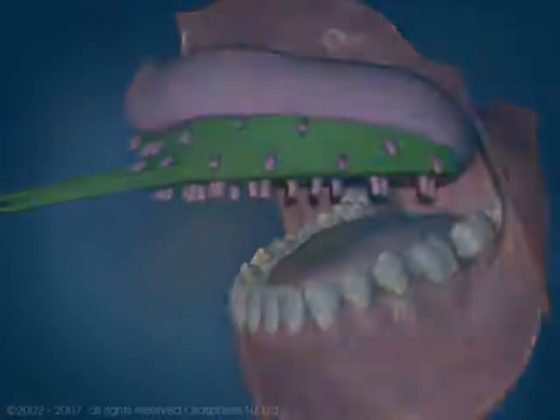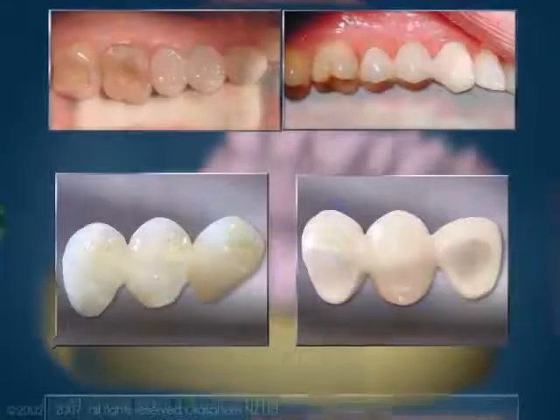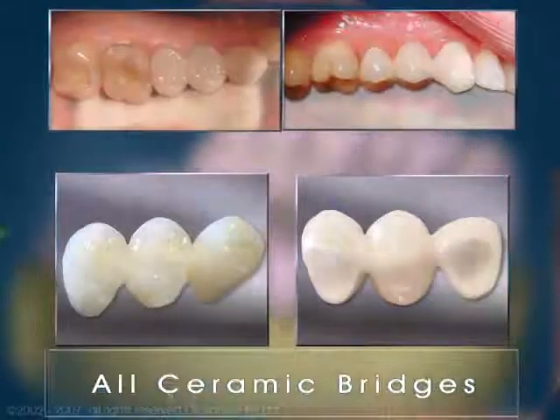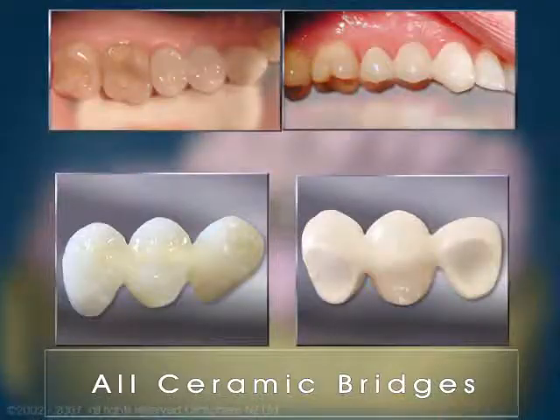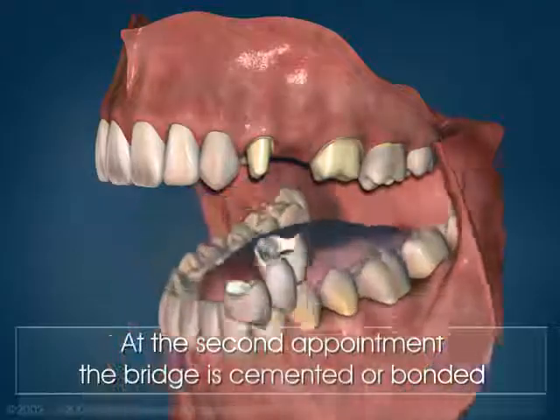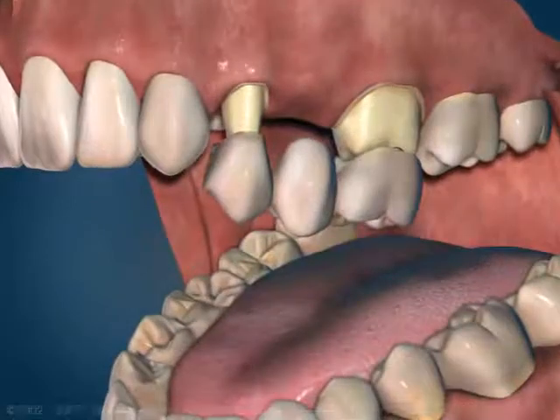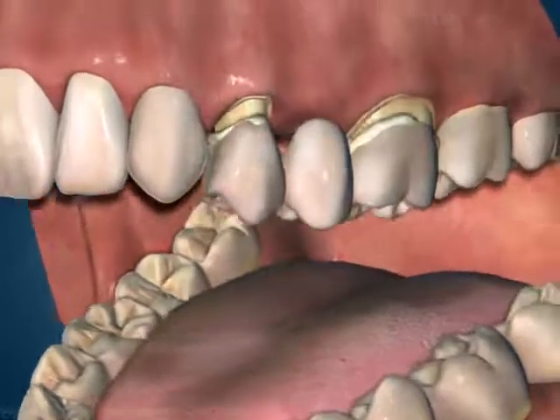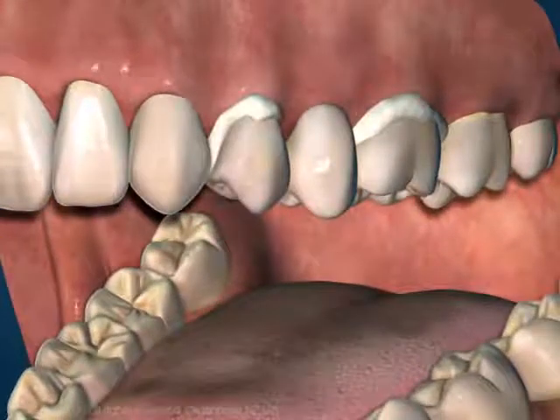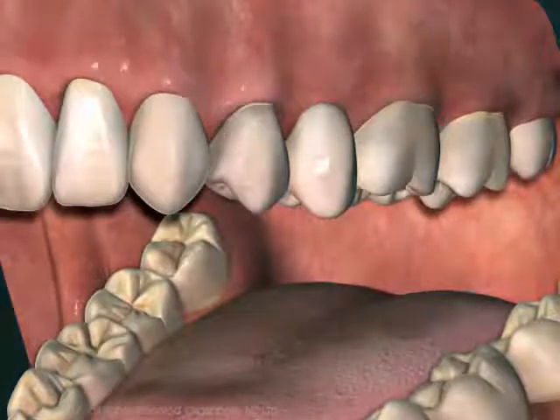The impression is used by a lab technician to make the bridge. At the second appointment, the bridge is cemented into place. Any excess cement is removed, completing the procedure.